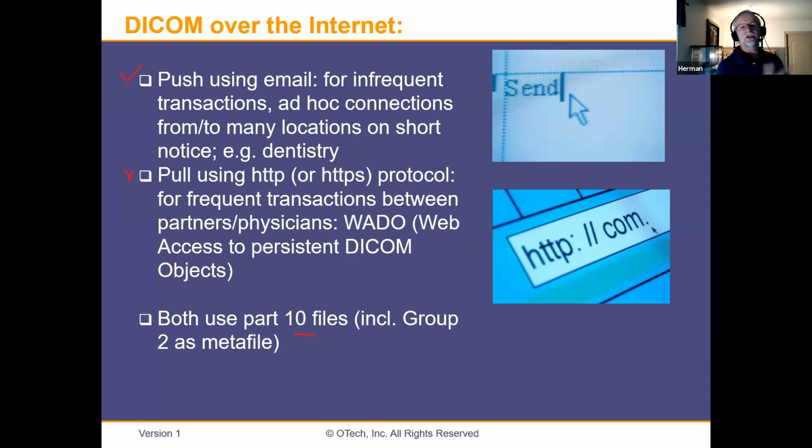So part of that association will be the format that it comes in, JPEG, MPEG, explicit VR, little endian, big endian, right? Kind of the file that goes back and forth. Now, this whole negotiation part is not included anymore because we do a straight put, or post. So we need to then include some of the information in the header, the metadata header of it that we call in a Part 10 file.